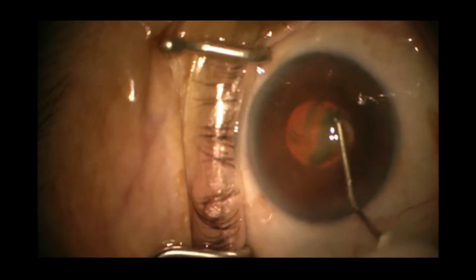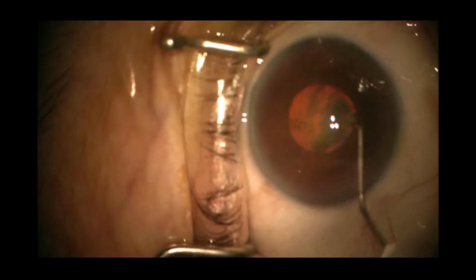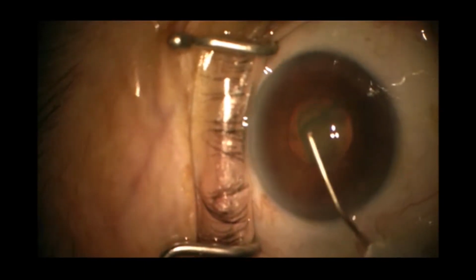Again we complete the rhexis. As long as we are able to maneuver the rhexis in an anti-clockwise direction, that means we haven't lost the rhexis. We just are trying to make a large rhexis.